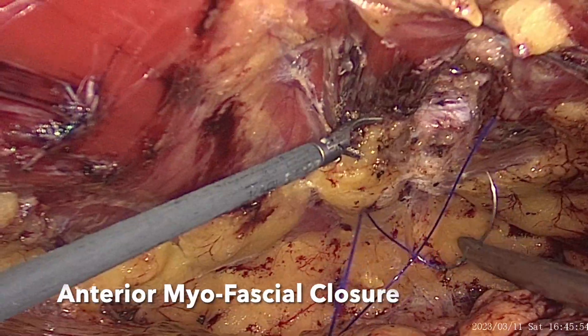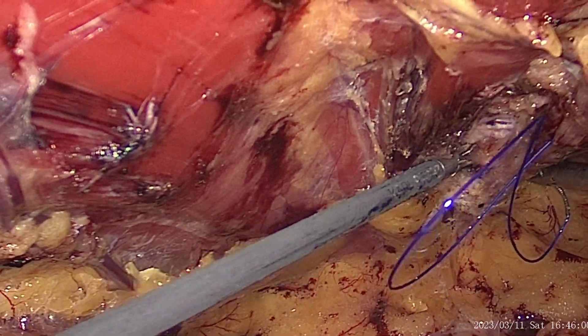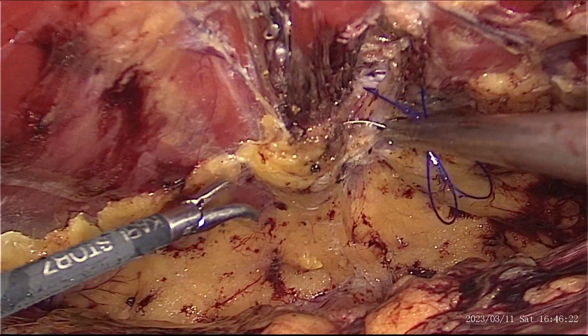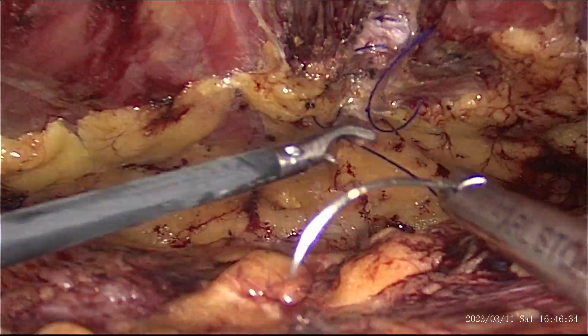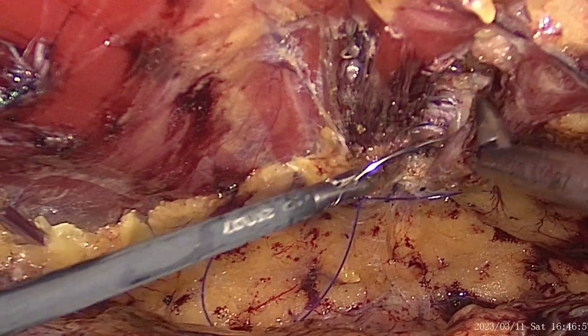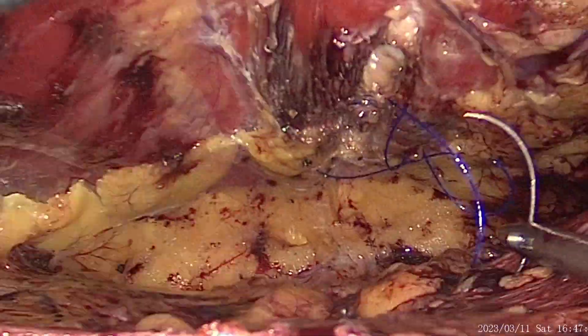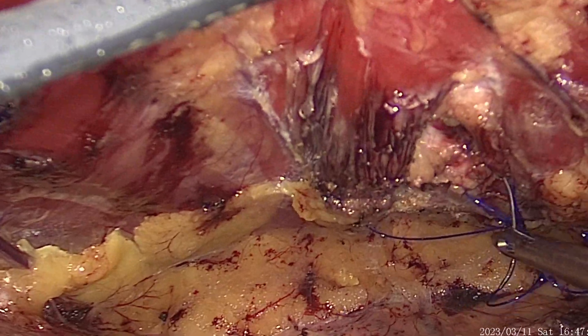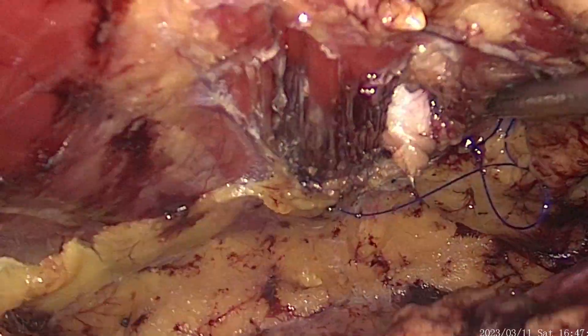The anterior myofascial closure is done using a transfascial stitch with a Prolene 1-0 on needle suture. The defect is closed in a continuous fashion with incorporation of the external oblique, or the external fascia, along with it.